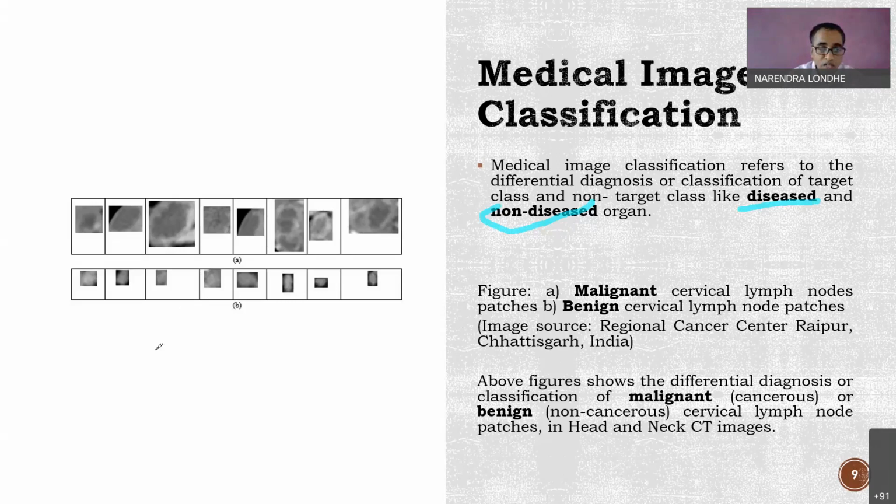So you can see these are some images that we have taken here. These are the lymph node images. After doing the segmentation, there will be a segmented area. It will be circular, semicircular, or have some odd boundary. Obviously, that part in the images in your computer system cannot be a random shape. It can only be a matrix shape. So it can be a rectangle or a square.